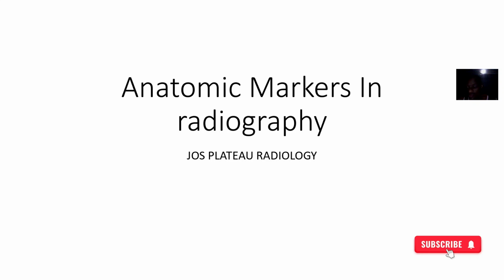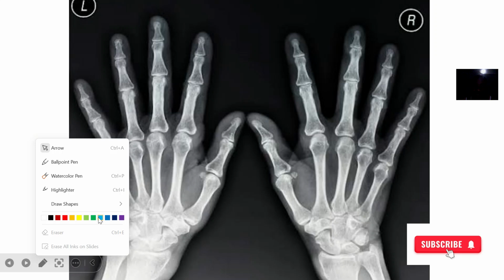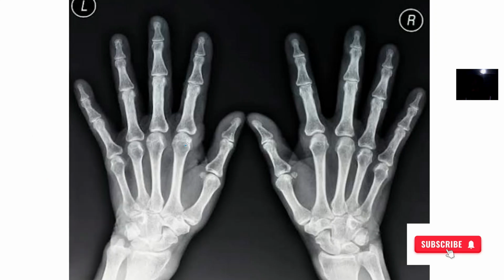So in radiology, if I say anatomic markers, what do I mean by the word anatomic markers? Anatomic markers is just simply a particular place on the body. If I do an imaging now, probably this imaging is just showing this part and not the whole hand. So how am I able to know that, first of all, this place is the hand, and how am I able to locate that part of the hand?